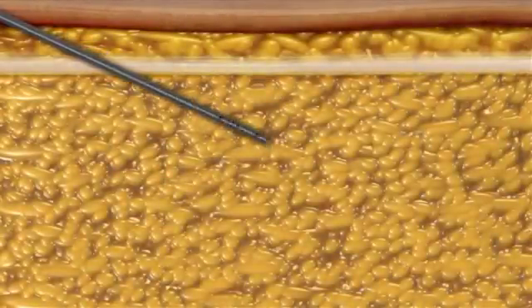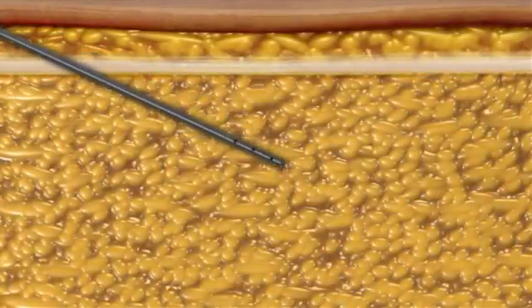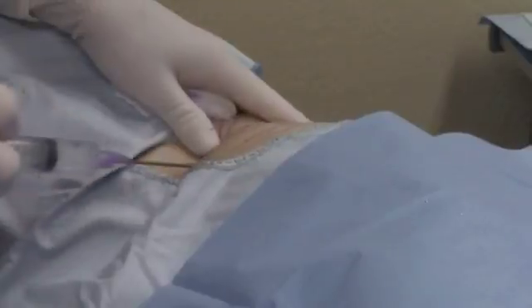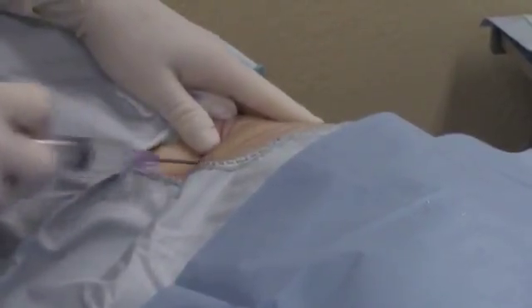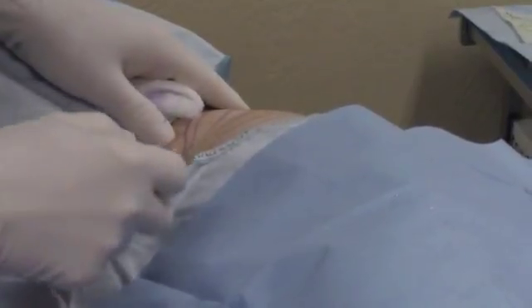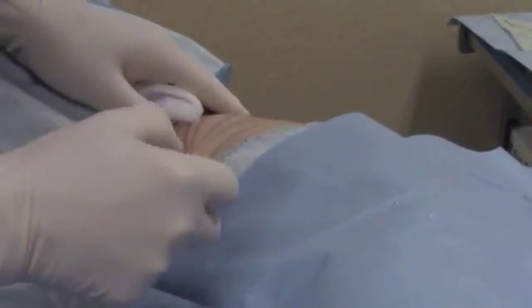The cannula should perforate and remain below Scarpa's fascia in the abdomen. Pass the infiltrator cannula in a horizontal manner within the fat deposit, creating a spokes-on-the-wheel pattern. Slowly inject tumescent fluid during both entry and withdrawal strokes.